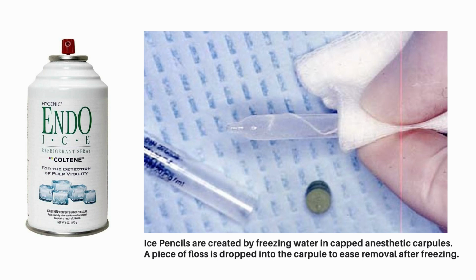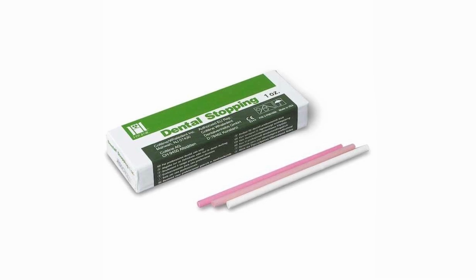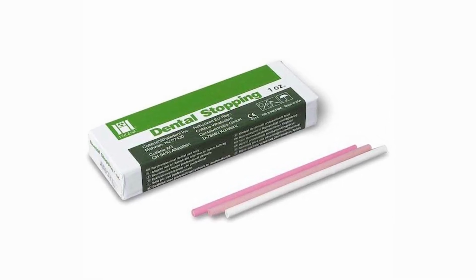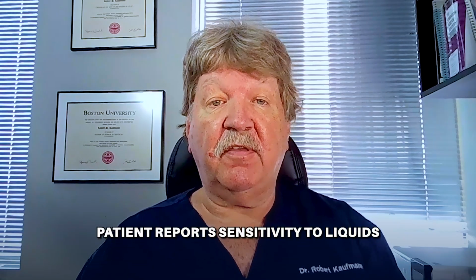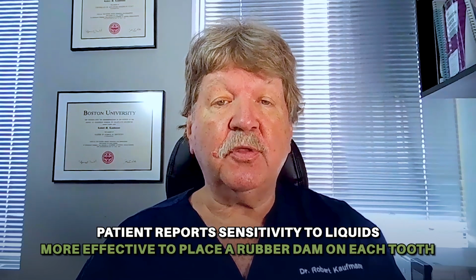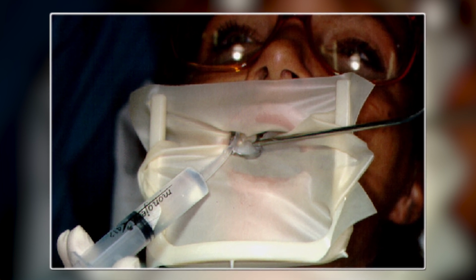Standard tests for pulp vitality are thermal and electric. Thermal tests are performed with Endo ice as a cold stimulus or an ice pencil, and another thermal test that we can use is heat with a generating material such as heated dental stopping compound or heat tests with hot water. In specific cases, where the patient reports sensitivity to liquids, it may be more effective to place a rubber dam on each tooth individually and then bathe the tooth in either hot or cold water to attempt to reproduce the patient's symptoms in the chair.